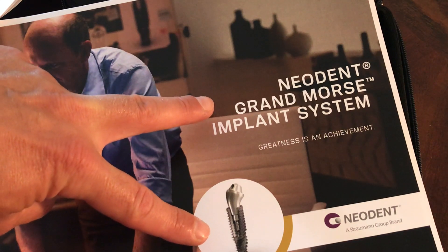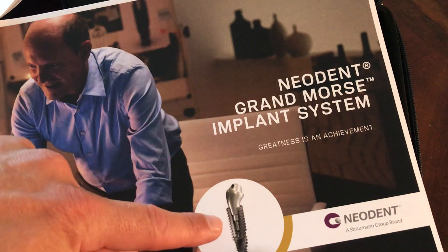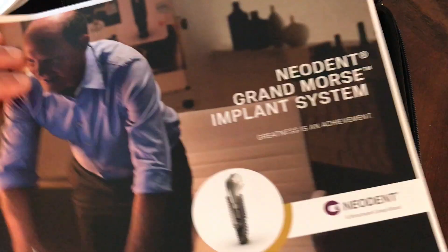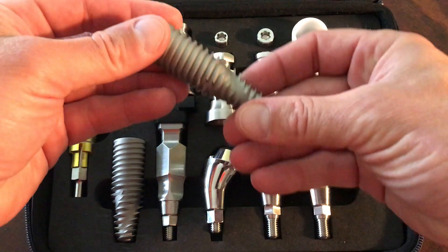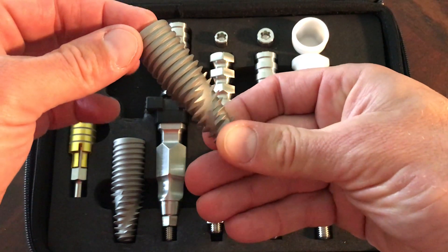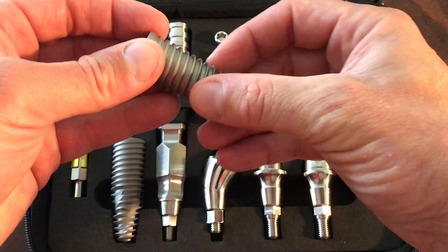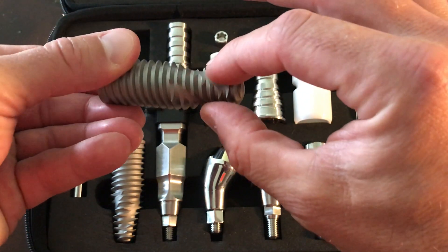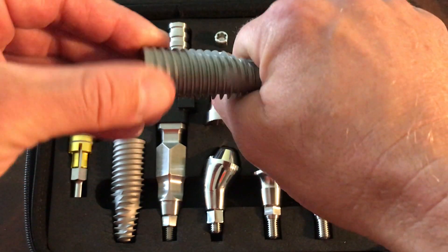Just doing a quick video today on the Grand Morse connection from Neodent, as well as going over the Helix implant, one of the new implants launched from Neodent. They gave us this nice kit so we can take a look at some of the features and benefits of this implant — great for primary stability and immediate placement. It has these really aggressive threads in a helicoidal shape that twist up around the bottom of this implant for great stability into bone.